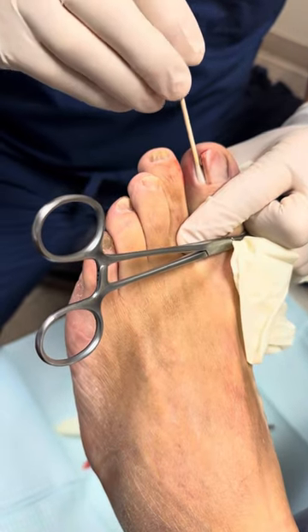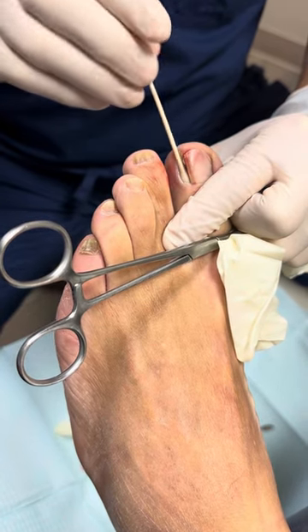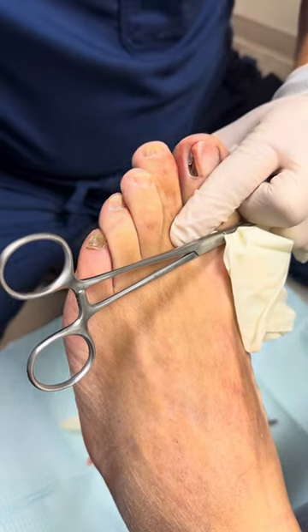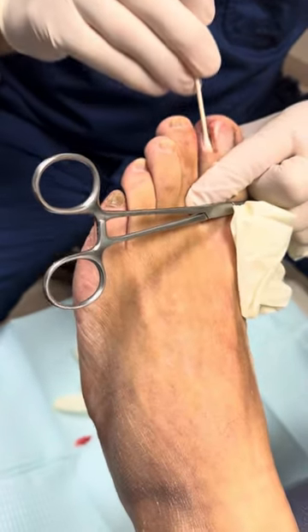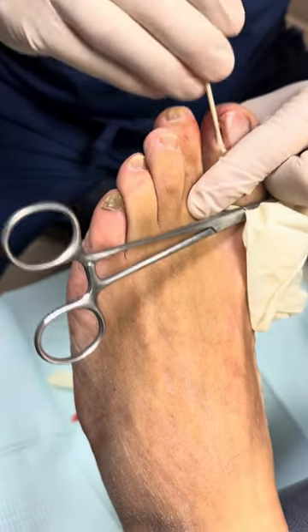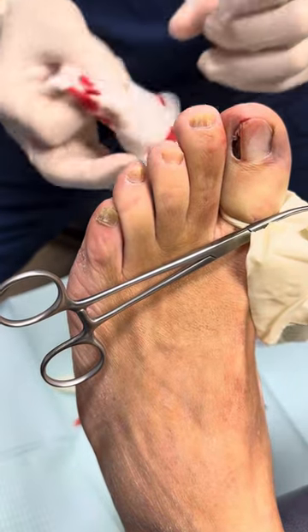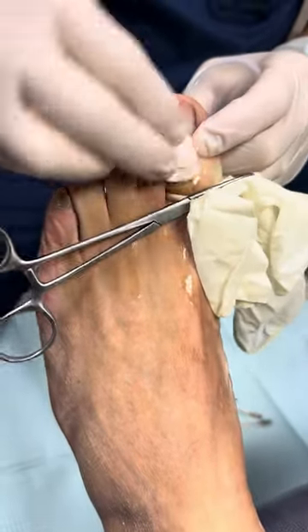After a couple Q-tips worth of that, we're going to flush this out with rubbing alcohol — isopropyl alcohol — just to flush the area out. We'll do that on some Q-tips first, and then put a little alcohol on gauze. We get in there with the Q-tip, technically diluting it a little bit — really just flushing it out to get it out of there.